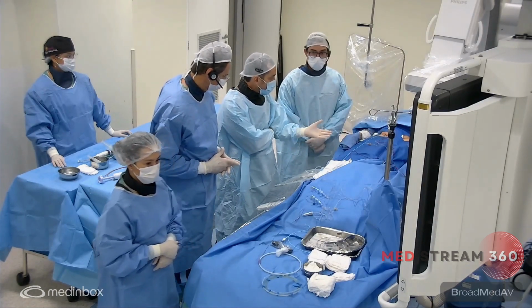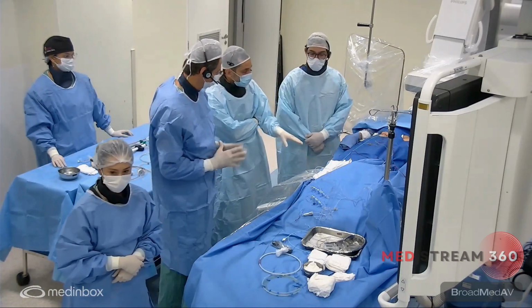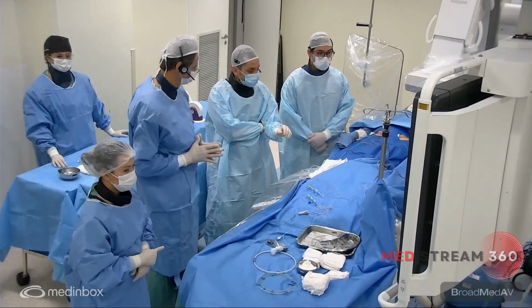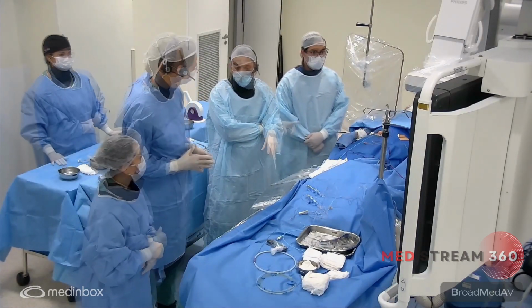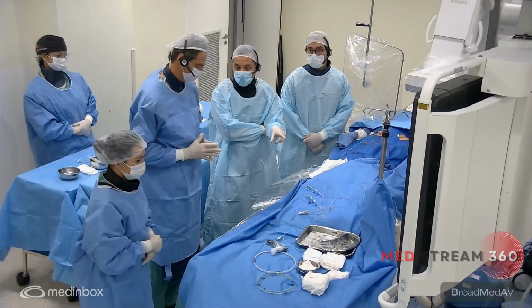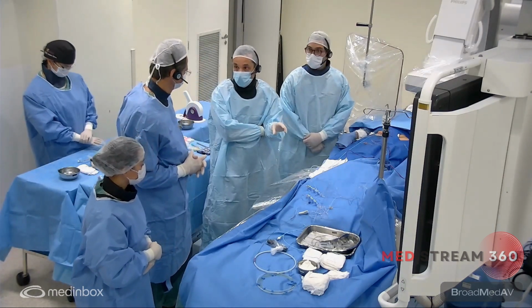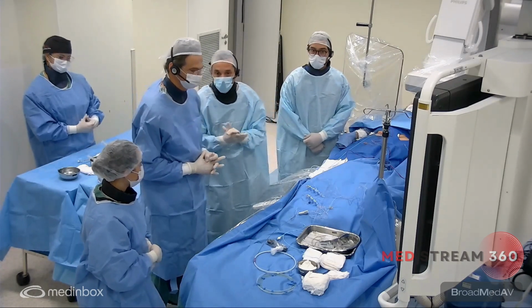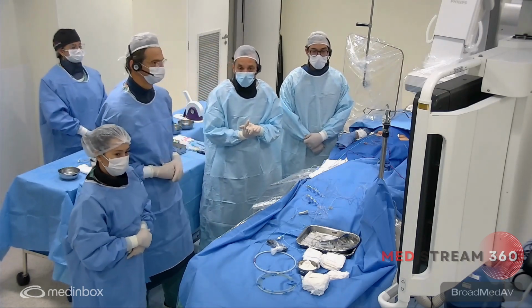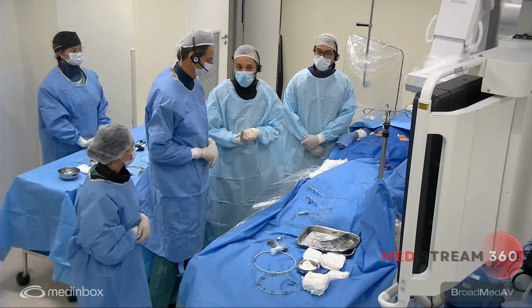This is a bicuspid, probably a bicuspid aortic valve. We're gonna predilate. It's our routine here to predilate. In bicuspid, do you always predilate? Yes. We tend to predilate all cases of bicuspid valves. In this particular case, we are in doubt about sizing. And we're gonna do a predilation and we're gonna inject some contrast during full balloon inflation just to size the valve that we're gonna implant. And I think this is an important maneuver when you are in doubt about sizing.